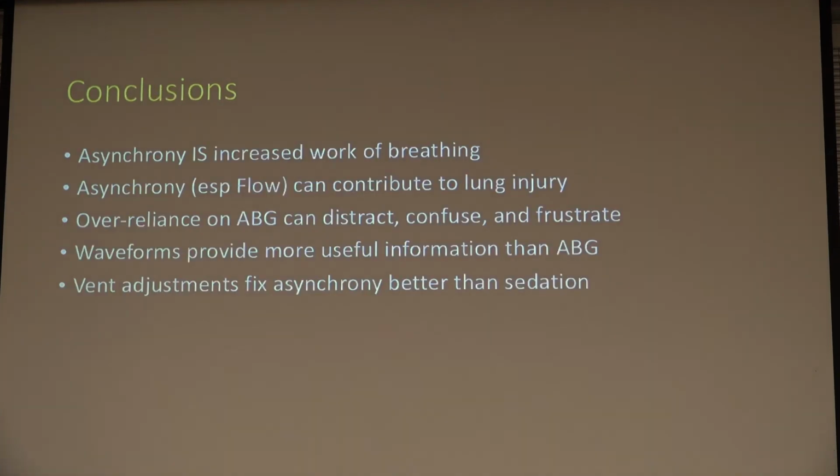Sorry about the graphics. All right, so in conclusion, asynchrony is increased work of breathing, something that we should try to get rid of, because asynchrony, especially flow asynchrony, can contribute to lung injury in our patients. Over-reliance on arterial blood gases can actually distract us from the real goals of our patients. They can confuse us and frustrate many people not understanding what the goals of ventilation are. Our waveforms actually provide much more useful information about how to safely manage our patients than a blood gas does. And ventilator adjustments fix asynchrony much better than sedation itself.